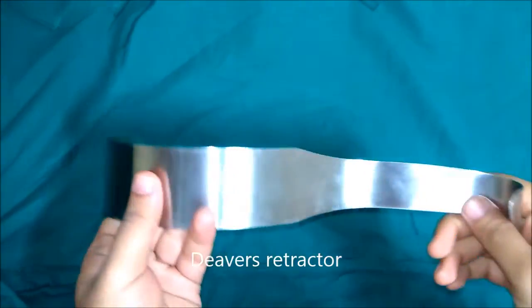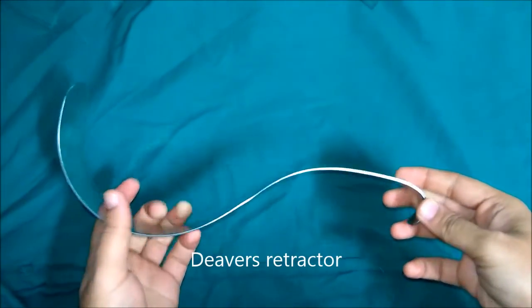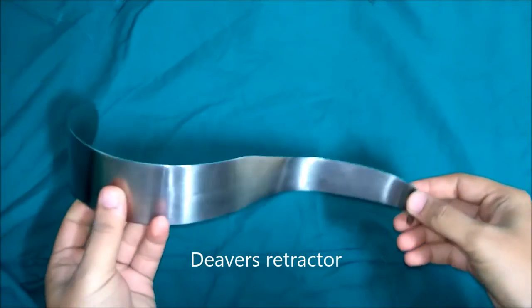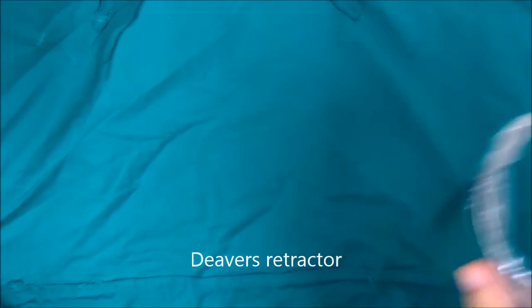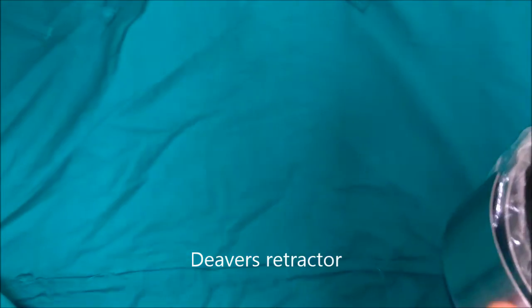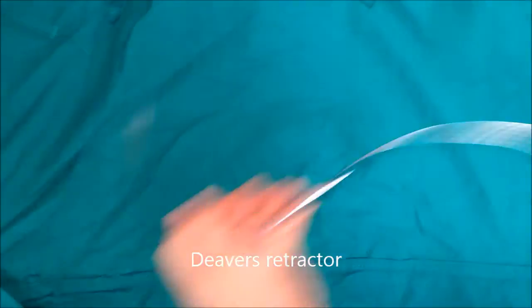This is Devers retractor. It can be used to retract the right or left lobe of the liver in operations like cholecystectomy or truncal vagotomy respectively. It can also be used to retract the stomach or the abdominal wall.